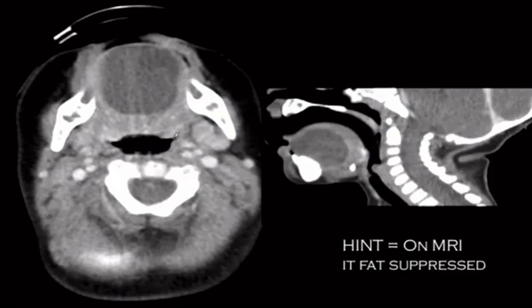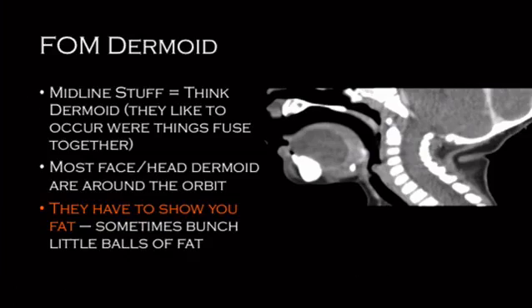We've got a cystic-looking thing on the floor of the mouth, and I'm giving you a hint that it's fat-suppressed. If there's fat in a mass, you think teratoma or dermoid or something like that. So this is a floor of the mouth dermoid — they do exist. Dermoids like to occur at midline structures, where things come together, though in the head and neck it's typically around the lateral portion of the orbit. They have to show you fat to make you call it a dermoid.